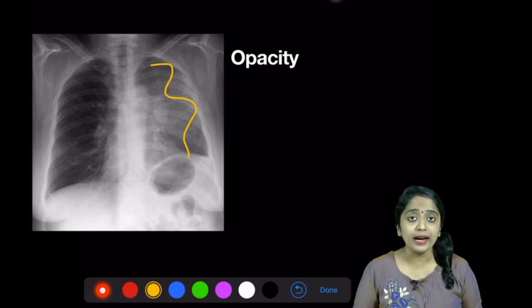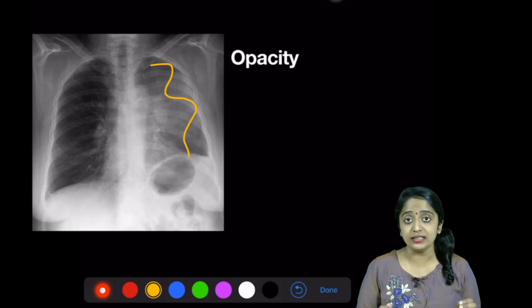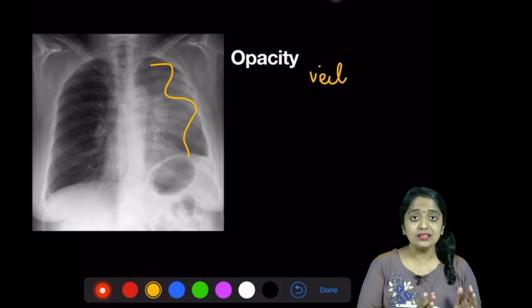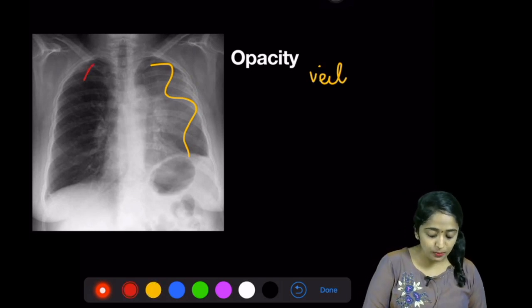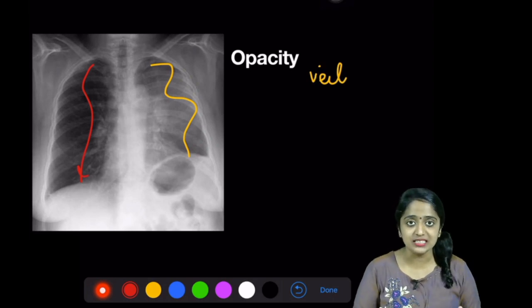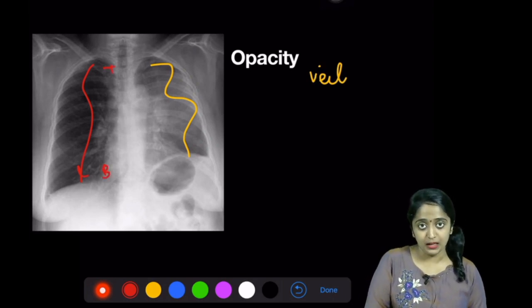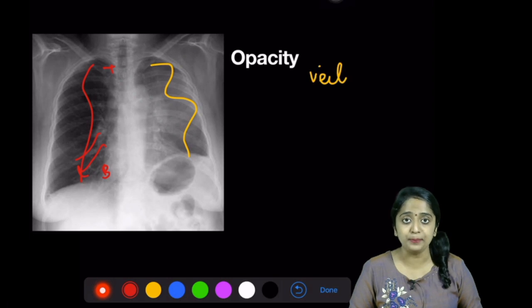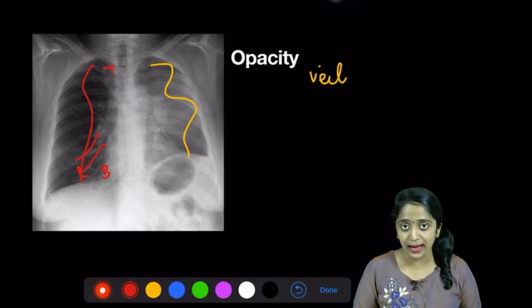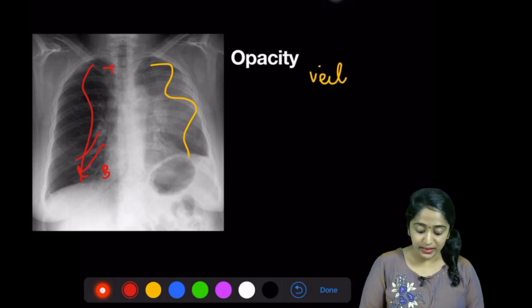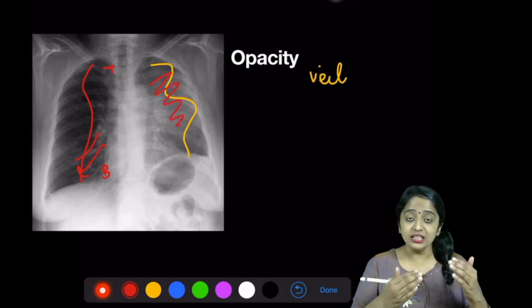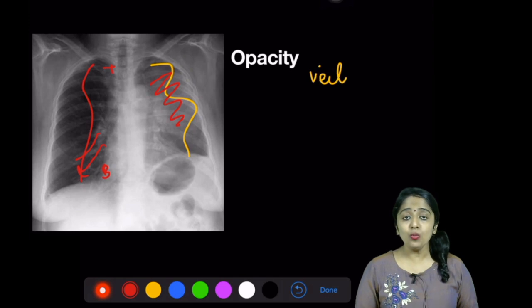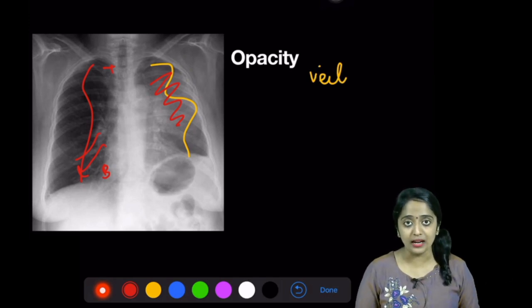Can we define the opacity further? I'm going to use the adjective of a veil-like opacity. Why? On the normal side, we know that radio density decreases from top to bottom, because at the bottom you have more vascular channels — that's why the bottom of the thorax appears more radio-dense. But in the left side, what is abnormal is that you can see an opacity that is decreasing from top to bottom — it resembles a veil. That's why it's called the veil-like opacity.